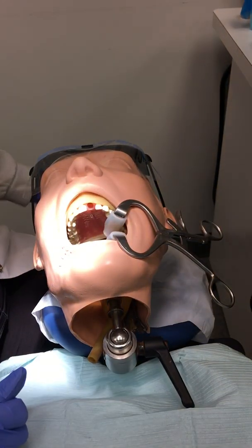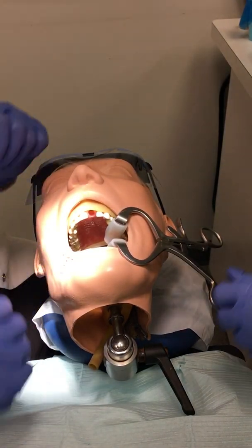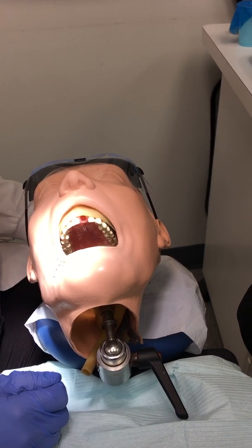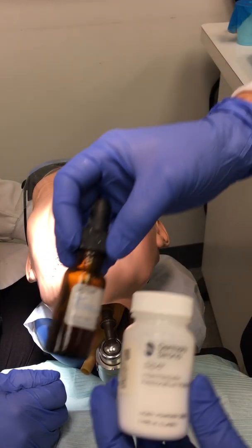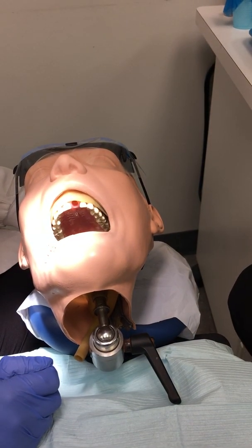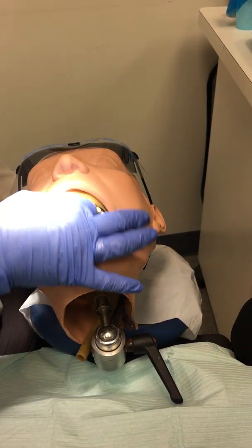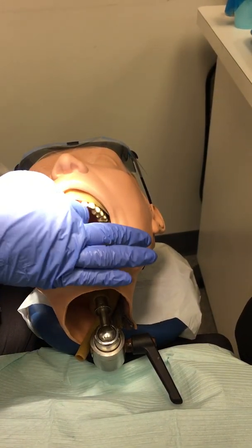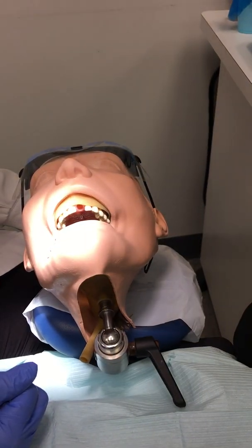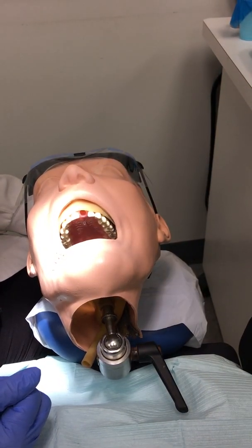Remove the dental dam. The dental assistant or doctor can place the temporary filling at this time. Check occlusion using articulating paper. The dental assistant will take a final PA and show the doctor for approval.